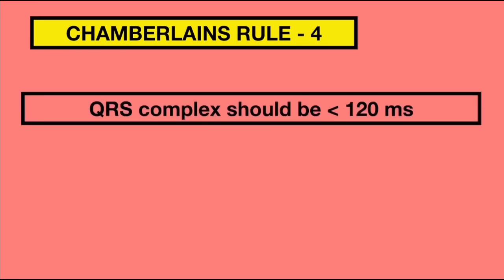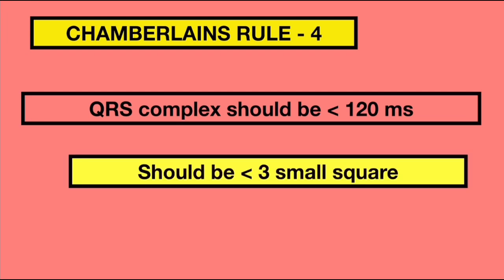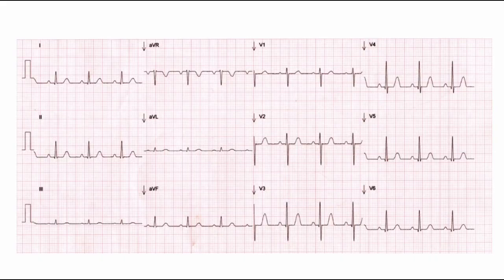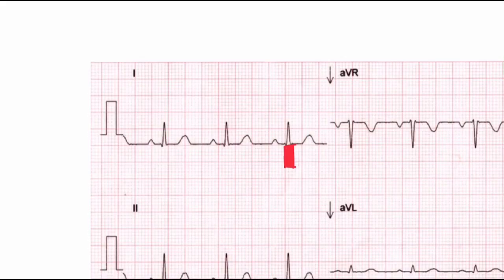Rule 4 states that the QRS complex should be less than 120 ms in duration, that is less than 3 small squares. In this ECG, we can see that the duration is 90 ms only.